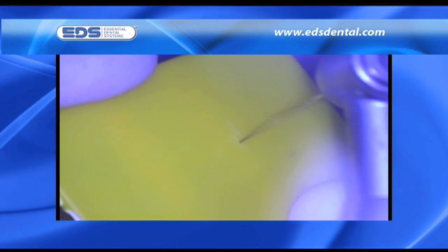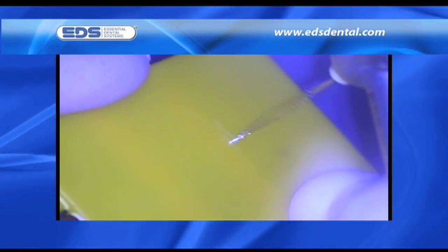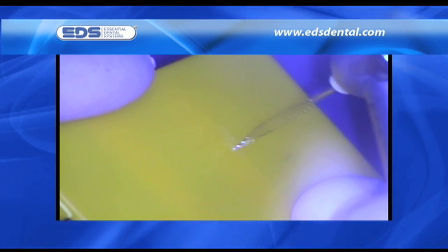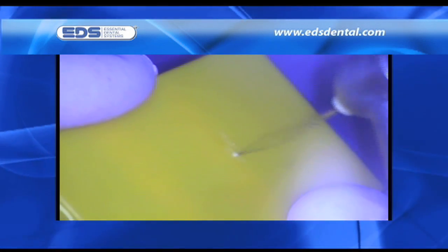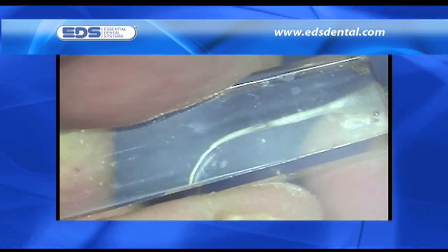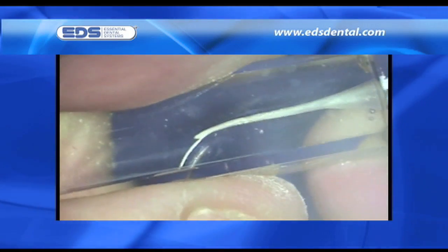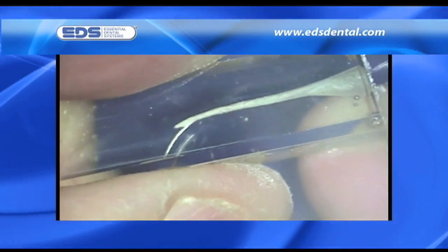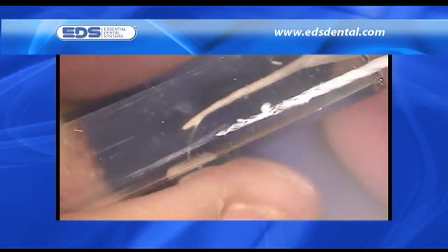Point contact around curved canals is enhanced via the use of the reciprocating handpiece. No matter how force is applied to the instrument in the canal, the point contact remains stable. Nor does the tip of the instrument create its own canal because the forward motion is limited to 30 degrees, preventing embedment into solid tooth structure. As you can see, the problem with rotary motion is it allows an instrument with a cutting tip to quite rapidly create its own pathway with minimal pressure applied — this is not what we want from a rotary system that is supposed to be protective of the canal anatomy in the apical third.